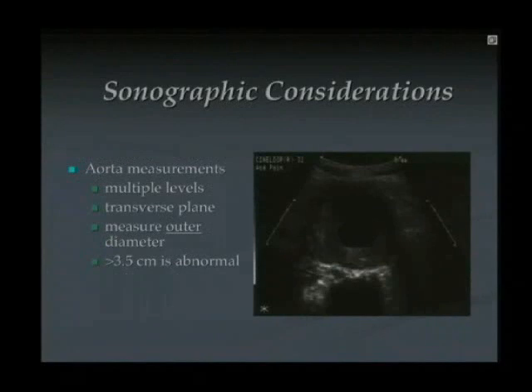For our purposes, anything above 3.5 centimeters is a problem. I always say never carry a coffin alone. Call for pallbearers. And in this sort of scenario, guess what? Get a formal study. Call the vascular surgeon. Call lots of people. Surround that bed. Don't you be the only person doing the heavy lifting.